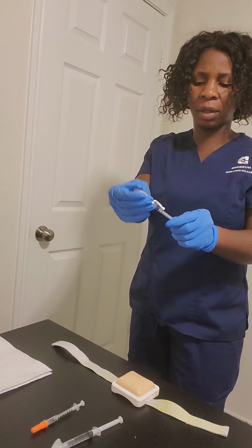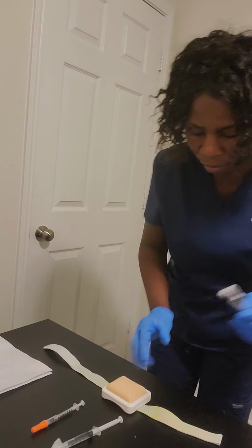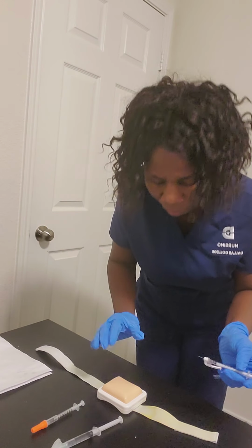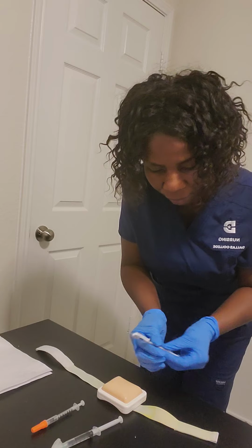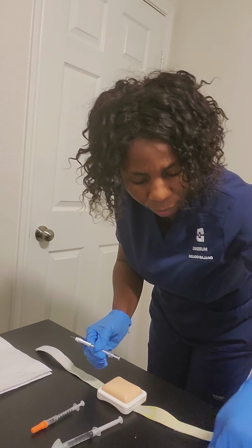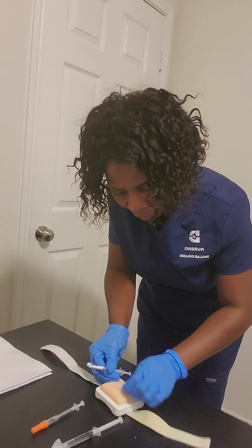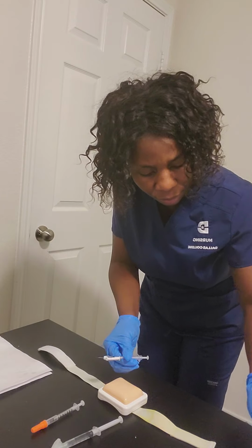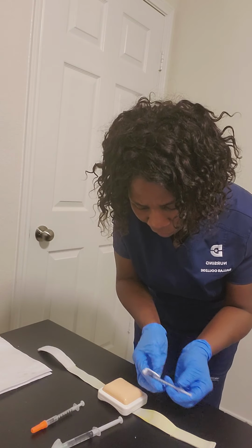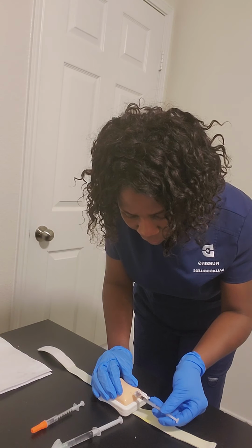I'm going to take the cap off of my injection. Now I'll be making sure that I wipe. I have enough here, so I'll wipe with the alcohol pad. I'll wipe, and I'm going to administer my injection, making sure the skin is visible. I'll be going this way.